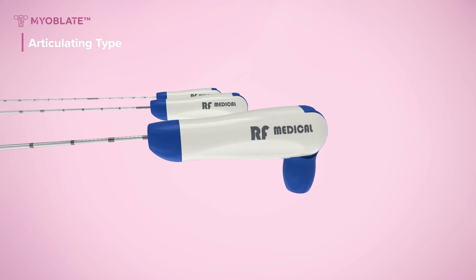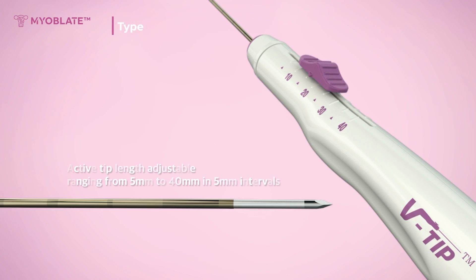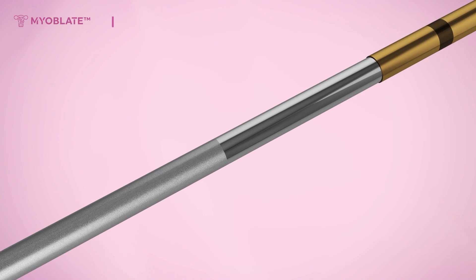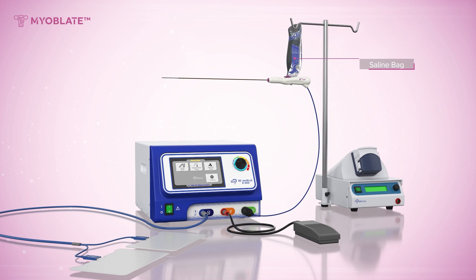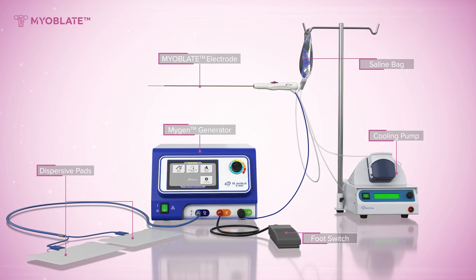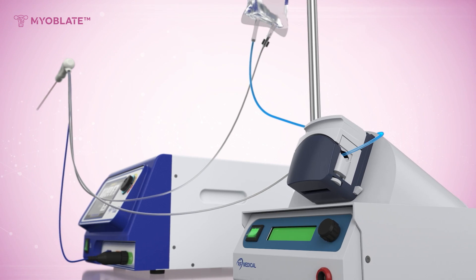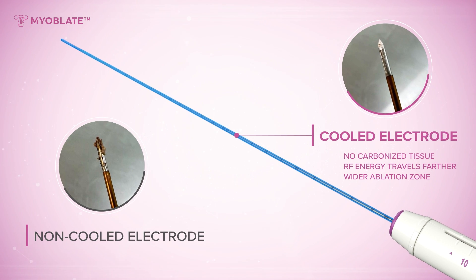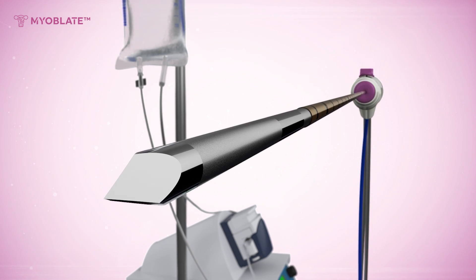Myoblate electrodes are available in a variety of lengths and active tip sizes. With two different distinct models to choose from, physicians have the flexibility and freedom to select the one that best suits their needs. Physicians select the appropriate electrode, connect it to the generator port, and ensure proper connection to the infusion pack for cooling saline circulation. Two grounding pads are placed, one for each thigh. Internally cooled electrodes prevent tissue carbonization while achieving a wider ablation zone, and they also have echogenic markings for easier ultrasound needle placement.